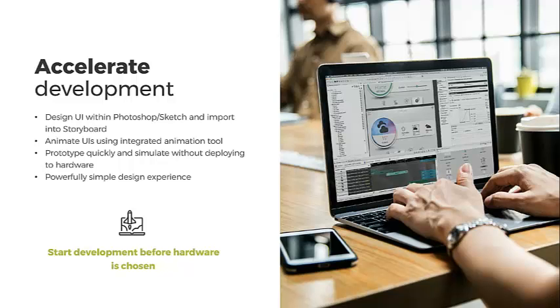And this is an area where, as I was saying before, in the medical world you wouldn't think animations are this important, but they want direct feedback. When a user's going through usability testing, them understanding and seeing how it works matters. A lot of these animations aren't so much to wow the eye and just be candy. A lot of times they're providing feedback. So instead of an up and down image, as you touch a button, it's a little pop of an animation. That's the kind of stuff.